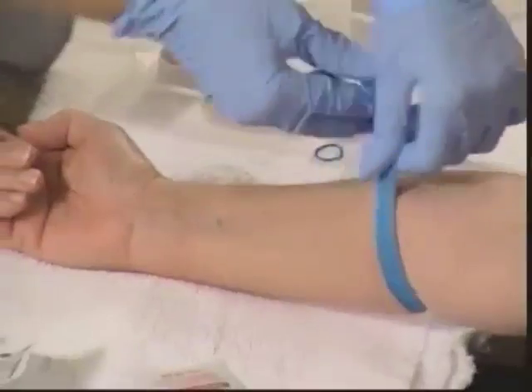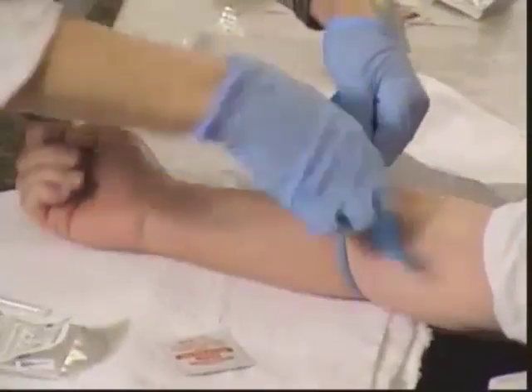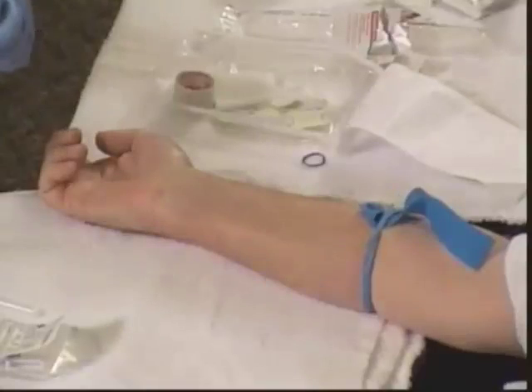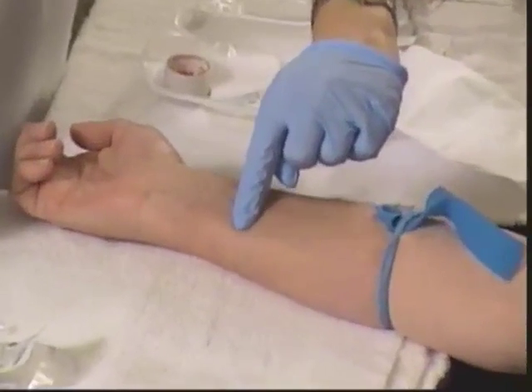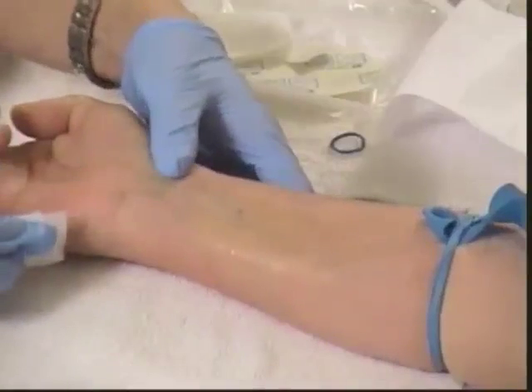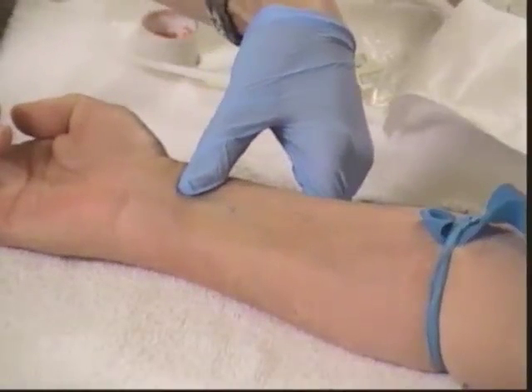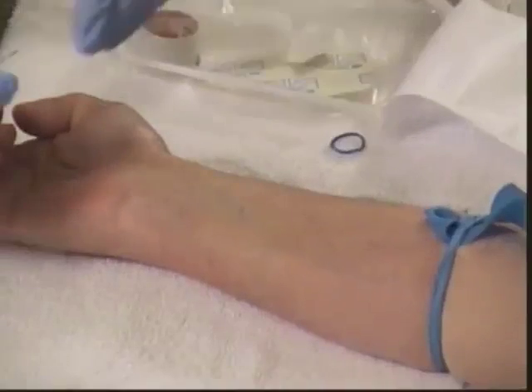The skin is cleaned and we're letting it dry. Now we're going to reapply the tourniquet. Remember, after cleaning we can't touch the insertion site again. If you need to feel the vein one more time, go back and clean it again — wiping from distal to proximal helps the vein stand up a little better right before you go in. Since I'm right-handed, I'm going to use my left thumb to pull backwards on the vein to anchor it and keep it from moving away. We'll take the needle cap off and make sure the bevel is facing up.